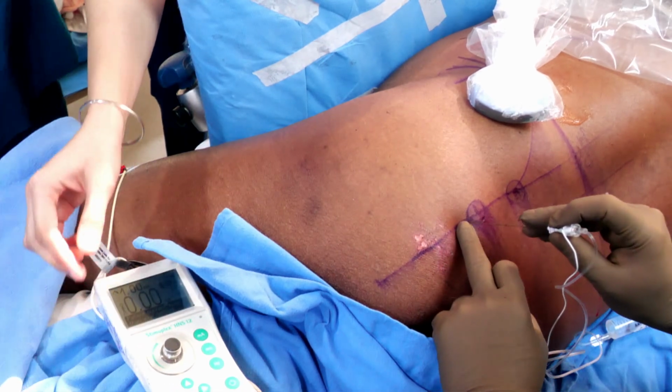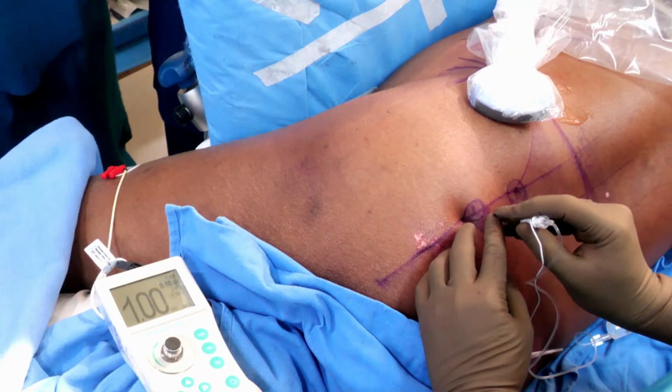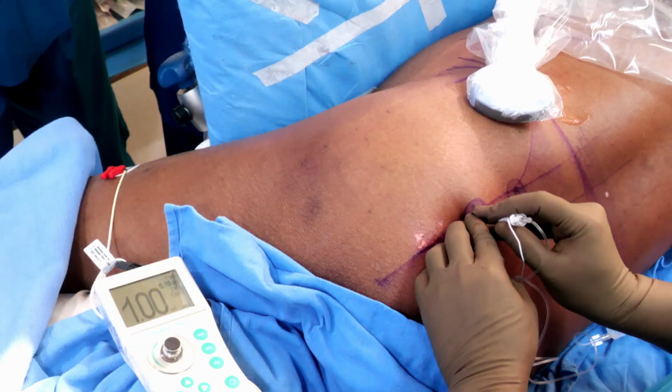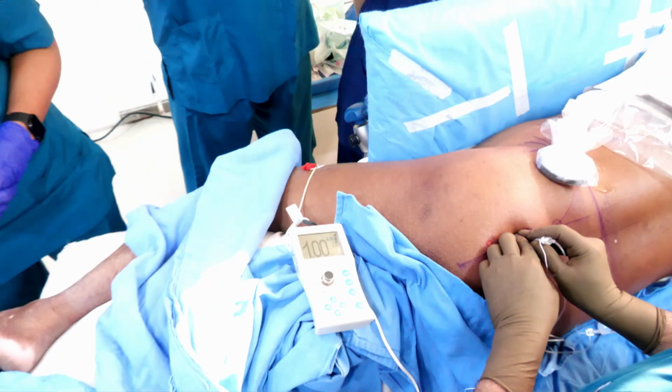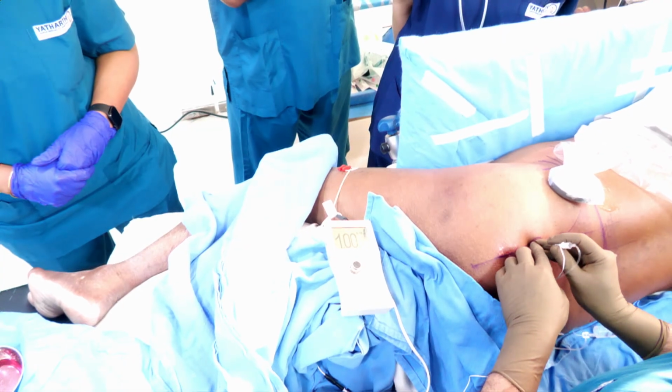So I'm changing the position of the needle insertion. Sacral plexus and lumbar plexus are known for multiple needle redirections, as well as being less tolerated by awake patients.